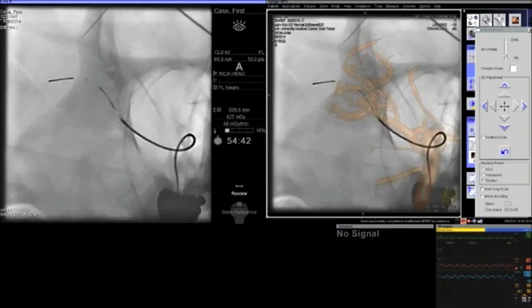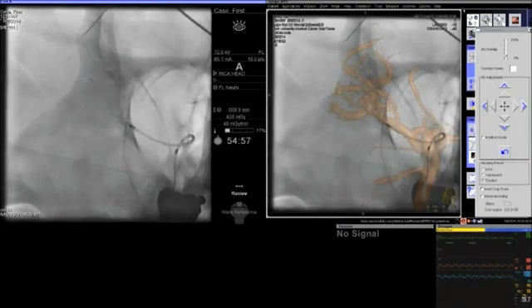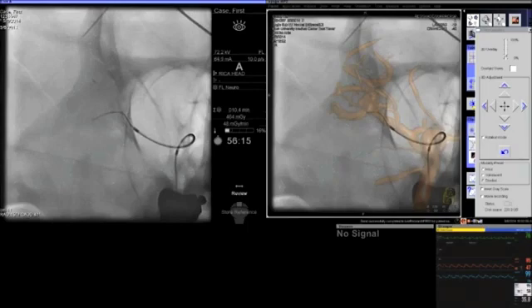Now, once you deploy the stent, you see that we were careful to have a very good purchase of the middle cerebral artery M2 segment and very little on the M1 segment. That was done to avoid placing multiple devices for a long segment of overlapping into the M1. Once we deploy the first, the microcatheter remains in position, and you use the Synchro 14 wire now to catheterize the second branch of the bifurcation. And in this case, this is an extremely important part. It has to be done without moving the first device.